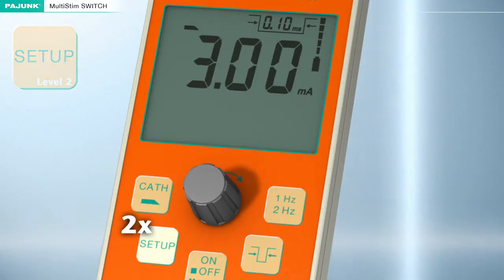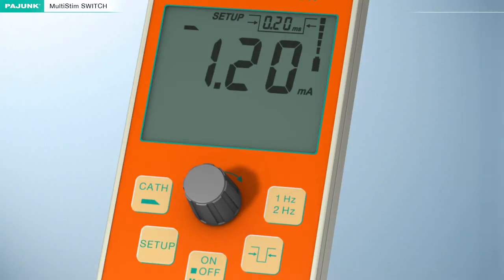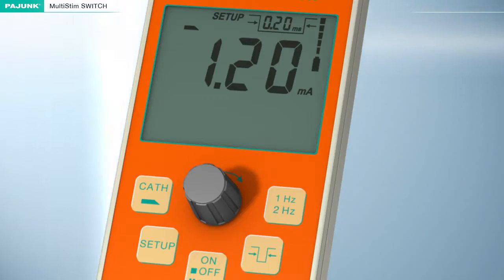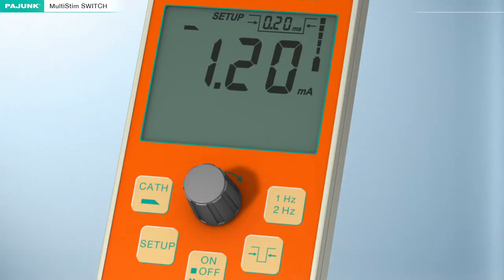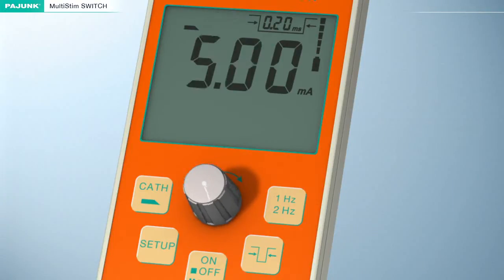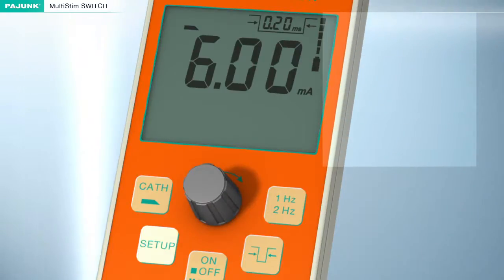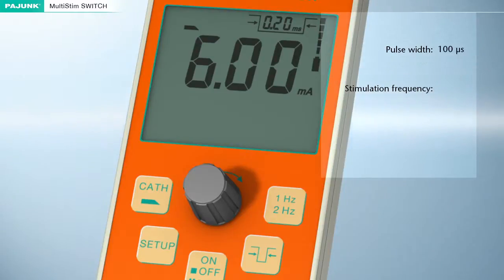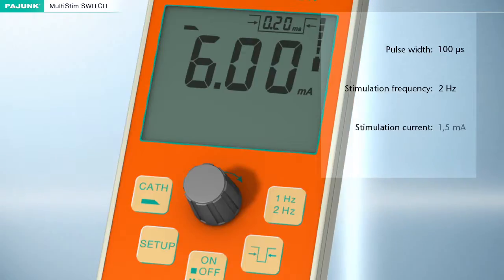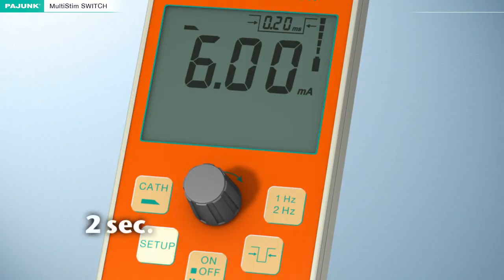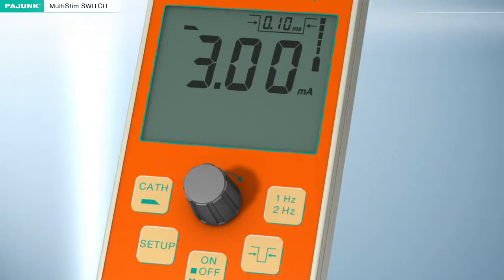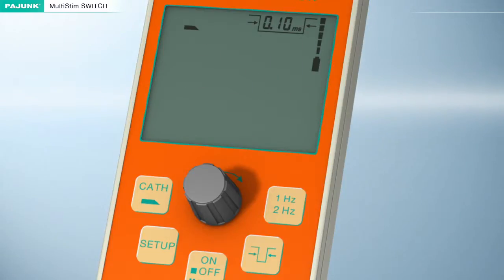Setup level 2: the cannula mode can be adjusted in level 2. Individual stimulation parameters differing from the manufacturer's default settings can be defined. The settings for the frequency and the impulse bandwidth must be adjusted in normal operation before pressing the Setup button for the first time. The intensity of the current can still be varied in the Setup function by turning this knob. The factory settings for the cannula mode are: pulse width 100 microseconds, stimulation frequency 2 Hz, stimulation current 1.5 mA. The Setup button must be pressed for at least 2 seconds to permanently store the values. A monitoring sound will be emitted upon successful storage, then the device will switch to pause mode automatically.